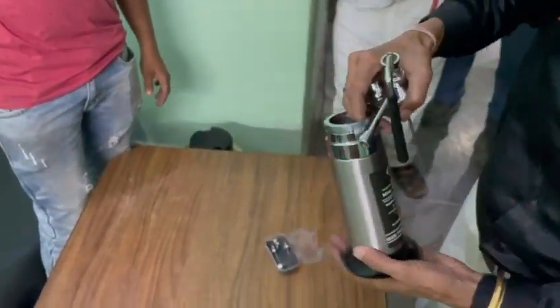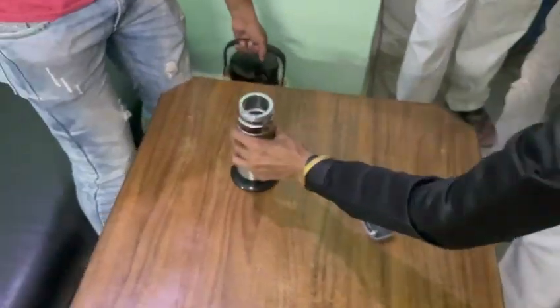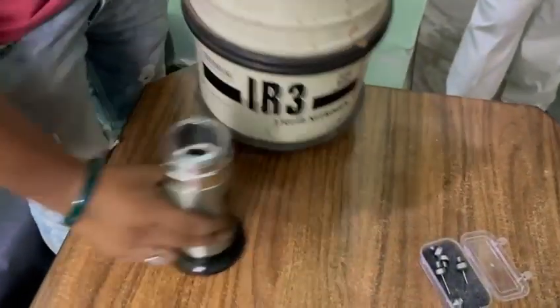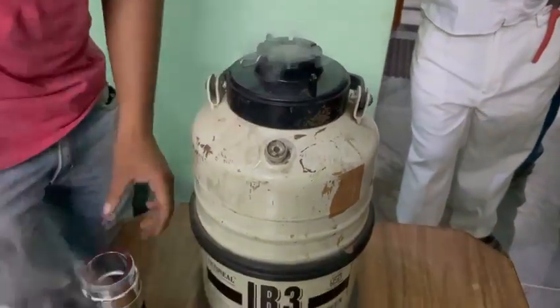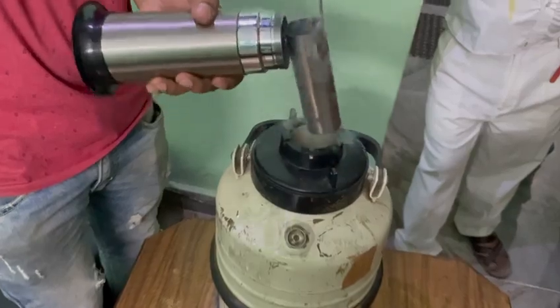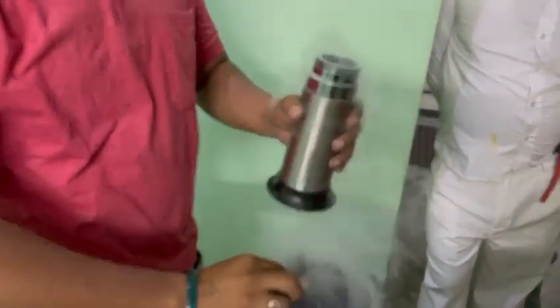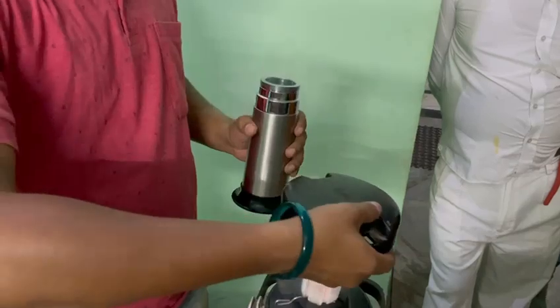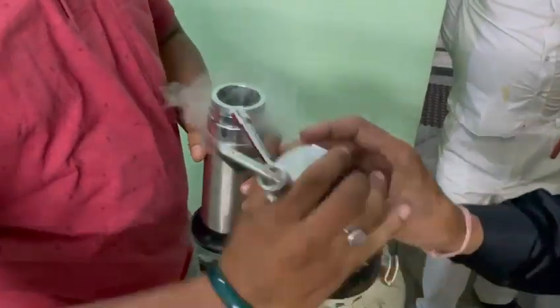You have to buy liquid nitrogen locally and fill it with the help of a funnel. This is a liquid nitrogen can. For testing purposes, we are showing you how to fill it. You can fill it using a funnel or a pot like this. After filling, tighten it properly.